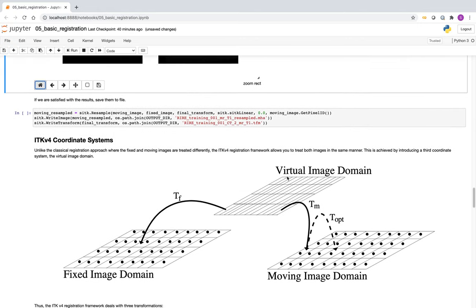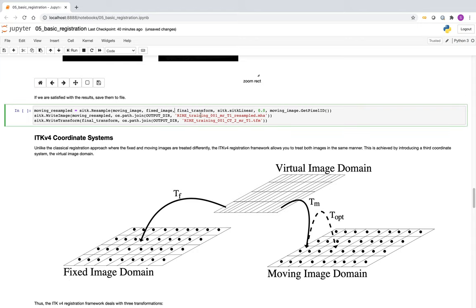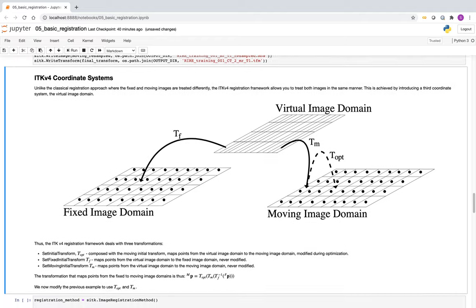If we're satisfied with the results, we can resample the moving image onto the fixed image. We also write the transformation to a file — it's now persistent on our hard drive.